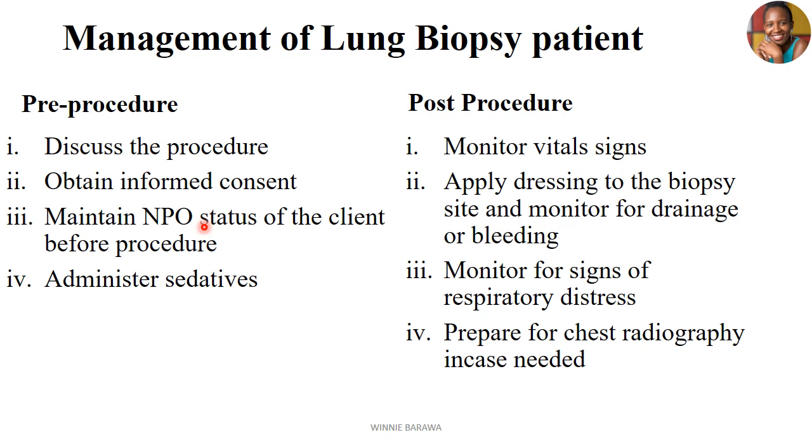Post-procedure, we monitor vitals because this client is partly coming from a sedated status and has also been anesthetized. Monitor these vitals to ensure that the patient has regained their normal status. Then apply dressings to the biopsy site.